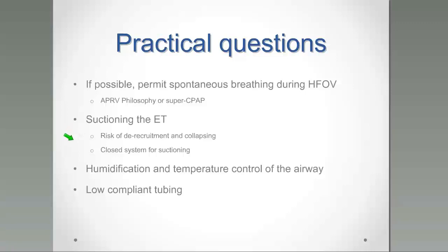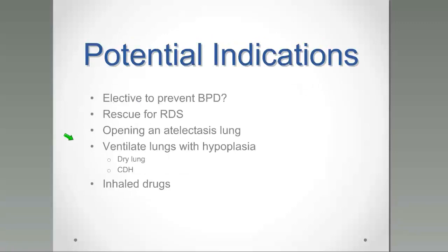Remember that it's important to have very good humidification and temperature control of the airway, and to use a low-compliance tubing system for this kind of ventilation.